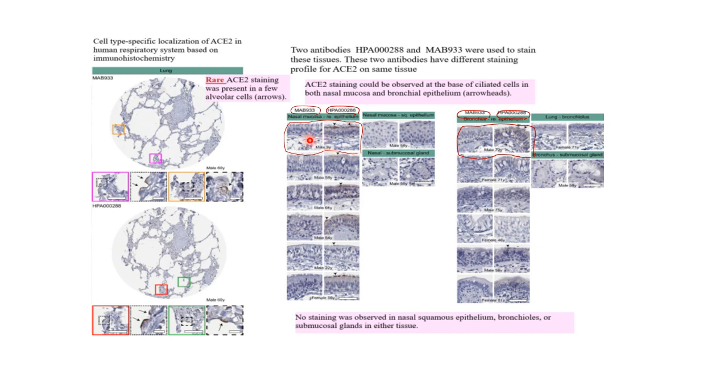So notice in this section, HPA000288 stains for ACE2, but from the same patient, MAB933 does not stain for ACE2.